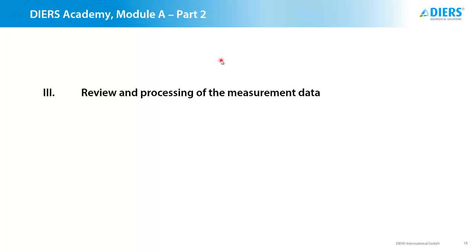Review and processing of the measurement data. Now, general remark, the more used you are to the system, the better your ambient light environment is, and the better you take into account that your patient has to be accommodated to the treadmill, the easier the review and the processing of the measurement data will be.